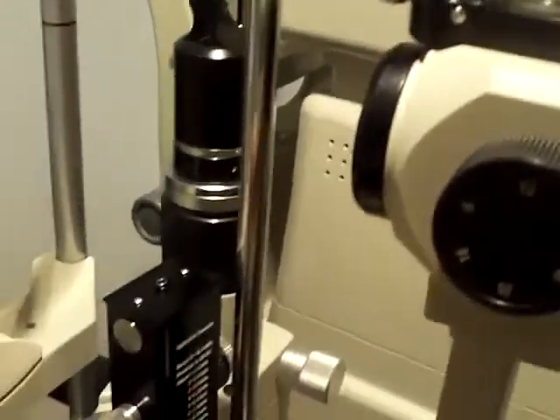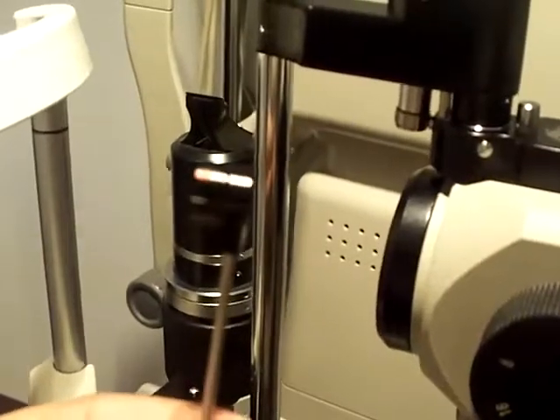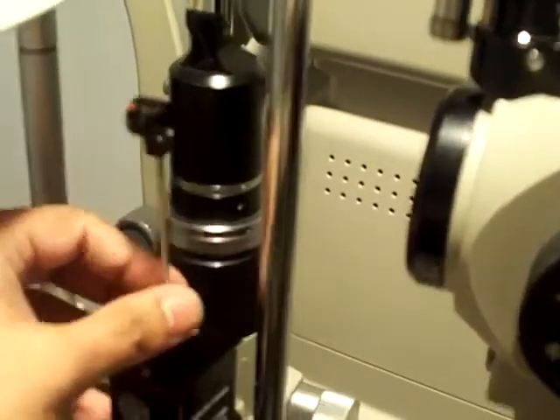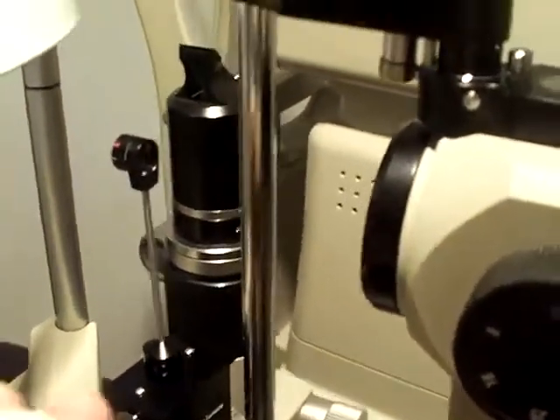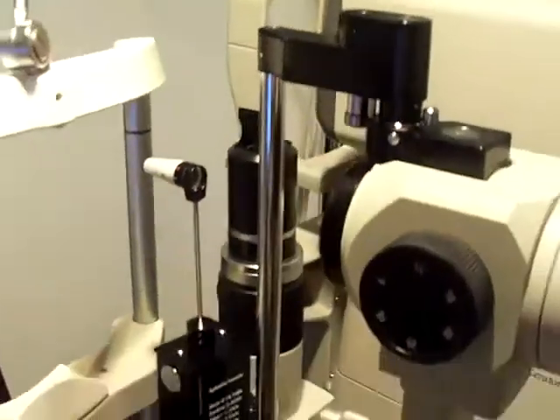Then get the prism holder, make sure the red tip is pointing forward, and just push it in place like so. Then put the prism in the mount. Now it's ready to use.